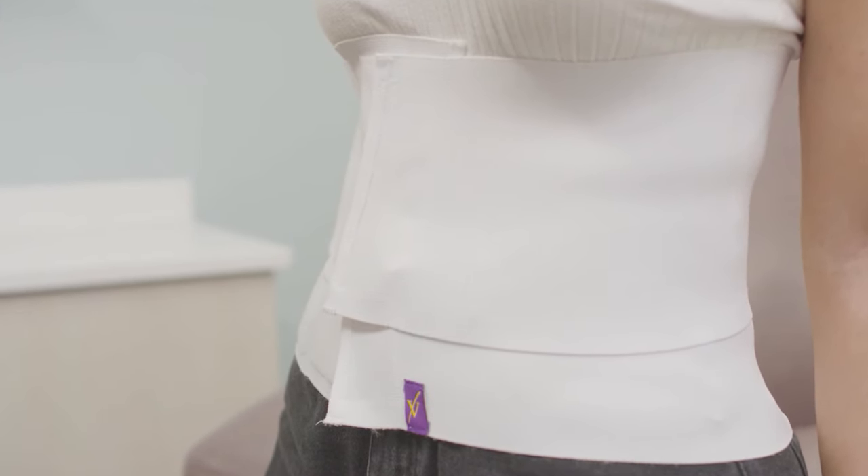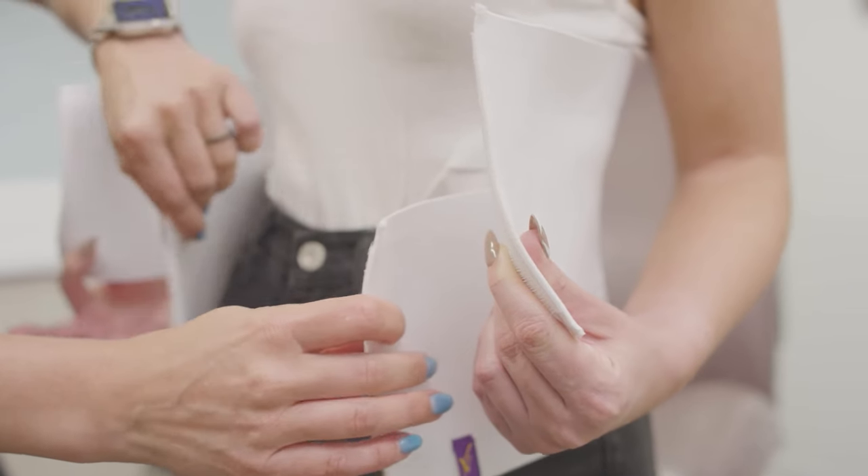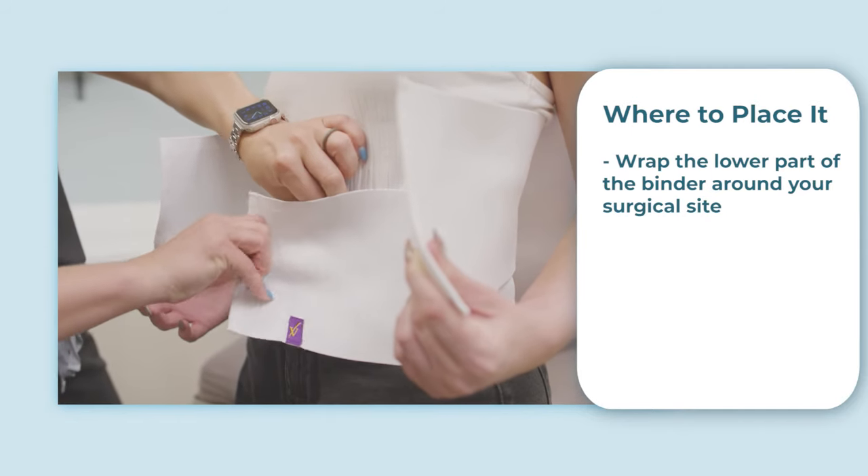The inside of the binder has no seam, while the outside simply uses Velcro to fasten. First, wrap the lower part of the binder around your surgical site from back to front and fasten it just above your hips using Velcro.